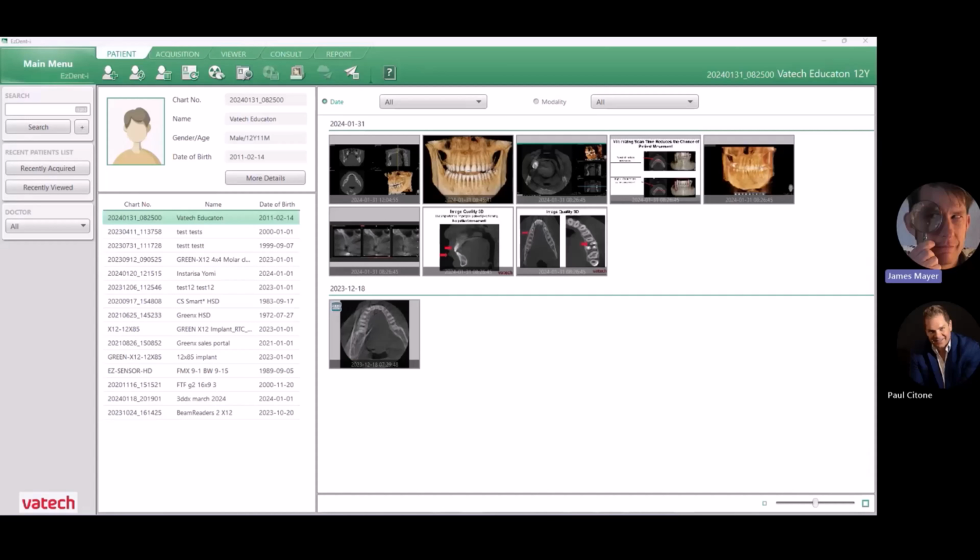So that's going to save a lot of headache for the office and the patient. So Paul, what really causes distortion whenever we get poor quality images? Well, the number one issue that we come across training clients is definitely patient movement. Making sure that the patient is secured in the machine, you have the temple rod secured, and clicking that acquisition button, ensuring that they're not moving, because if they move even the slightest bit, you can see some ghosting and distortion in that image, for sure.